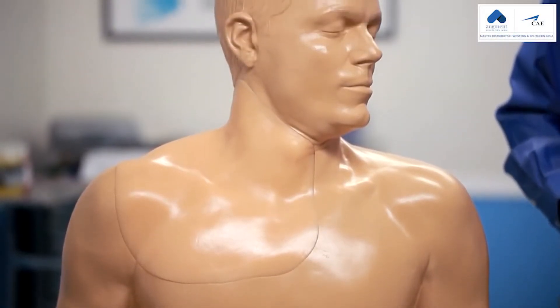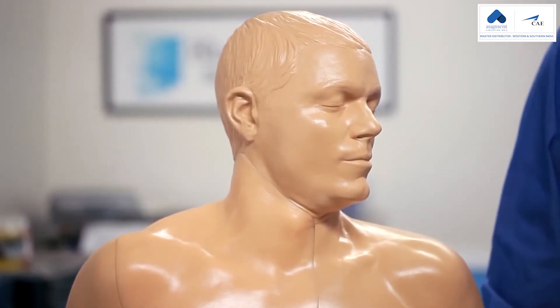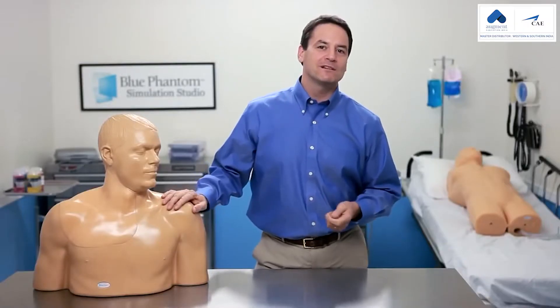I'd like to introduce you to our new upper torso, central venous access, and regional anesthesia ultrasound training model. This product offers the same realism, quality, and durability that you've come to expect from Blue Phantom.